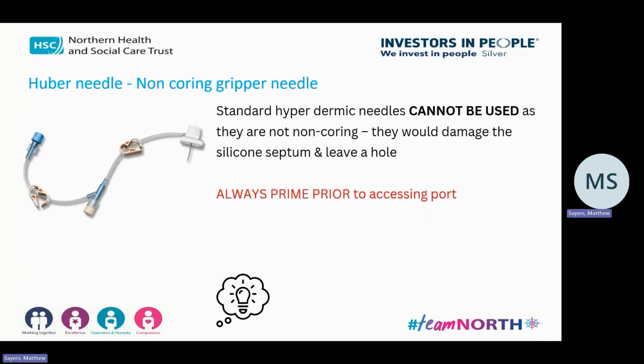The other thing to note, the needle in the pack comes with the extension on it, and it's really important to have that primed with your saline prior to accessing the port, because obviously we don't want to introduce any air at all. So you have to have that primed before you start accessing.